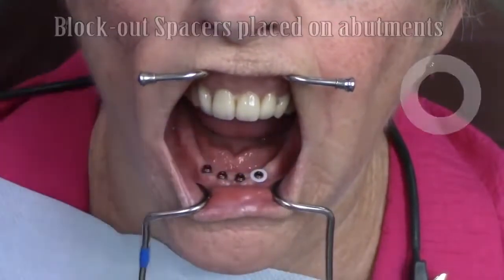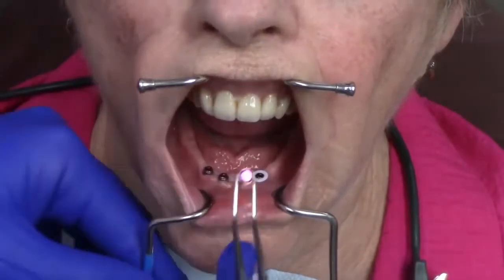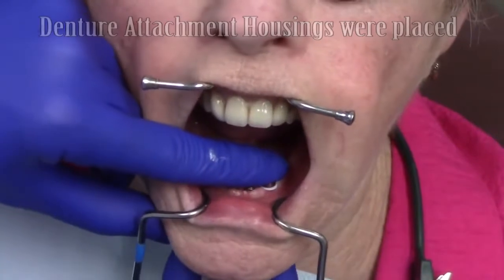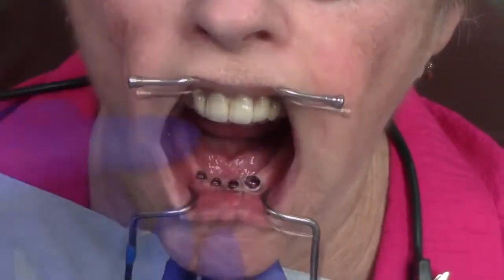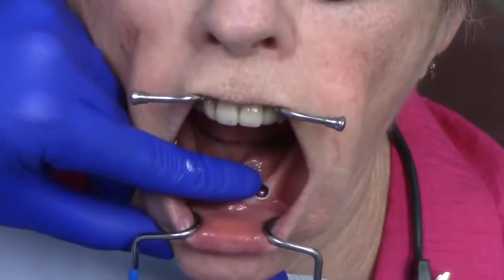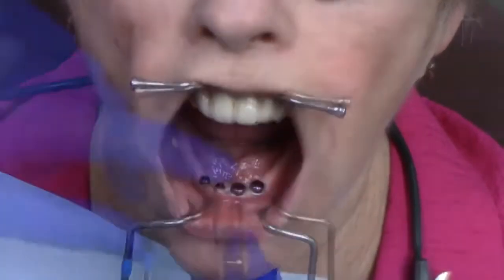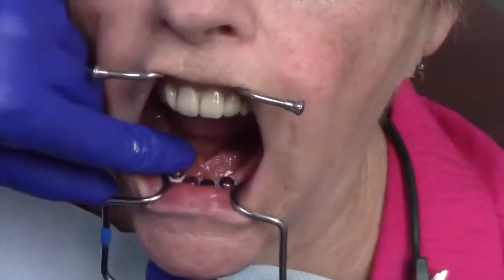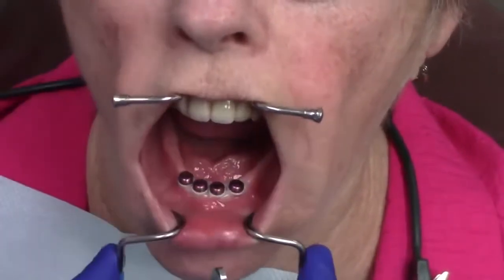The first step is to place blockout spacers lightly on top of the Locator RTX abutments. Immediately after placing blockout spacers, the denture attachment housings are placed on top of the Locator RTX abutments, slightly compressing the blockout spacers. I find it much easier to take the housing, approach the implant attachment abutment at a 45-degree angle and press.